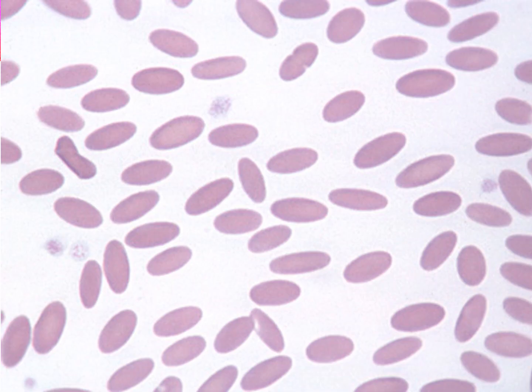Okay, here's an example from llama blood, and these are llama erythrocytes. As you can see, they are oval shaped instead of biconcave disc. However, they are mammals, so they do not have nucleated red blood cells.